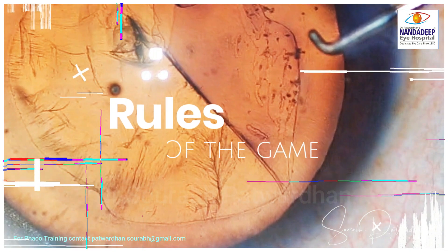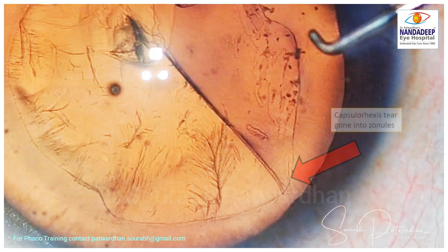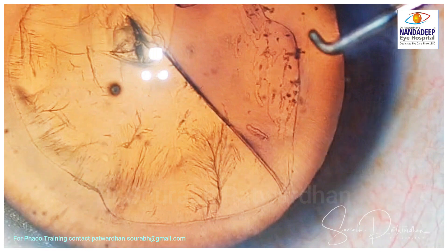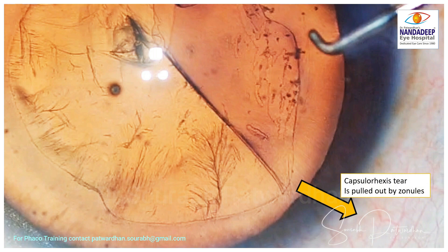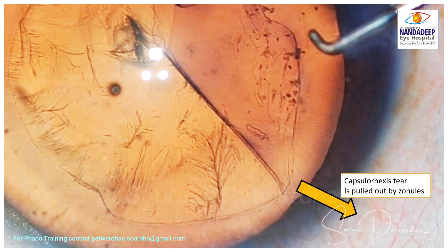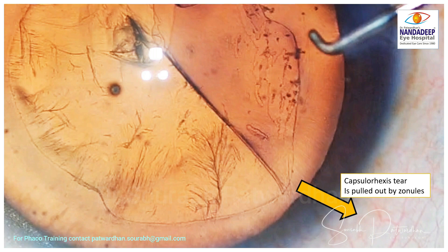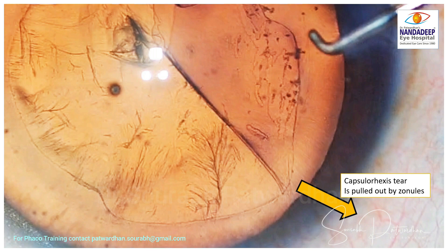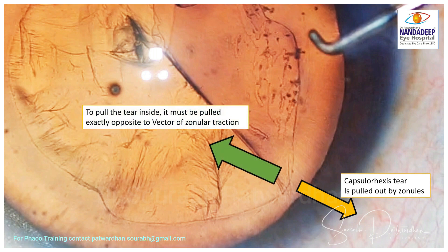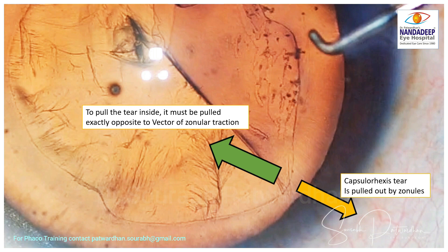Let's understand the rules of the game. When the capsulorhexis tear has gone into the zonules, it is being pulled outward by the zonules. Considering the physics involved in this situation, we have to pull the tear inside exactly opposite to the vector of the zonular traction.